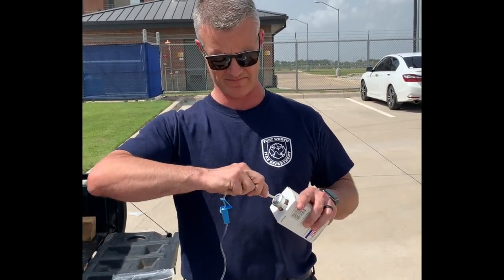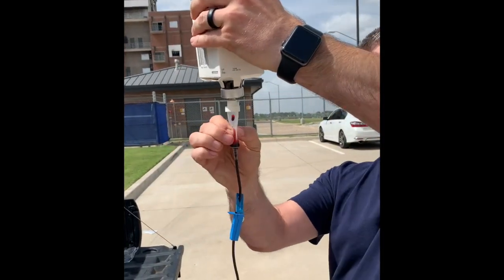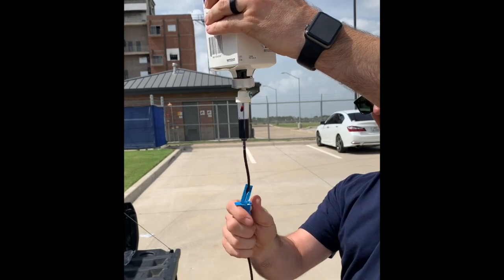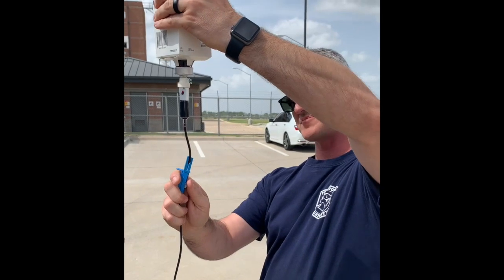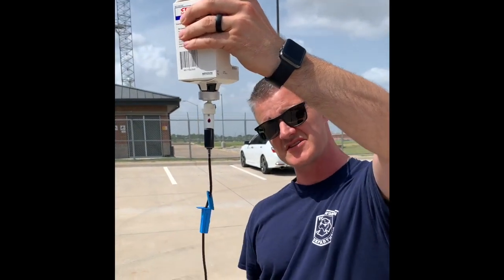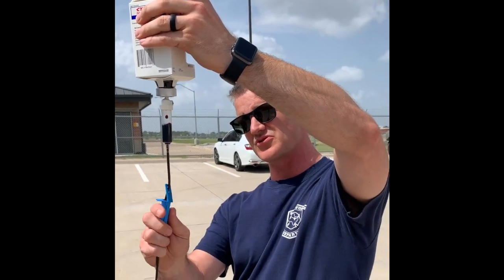After you've mixed and rocked your Cyanokit, you're going to stab it with this spike. Then you're going to fill that up to about the halfway point on this sight glass here. Open it up and you want about three drops a second. Your medics are going to tie this into a dedicated IV or IO access — you don't want to mix this with any other drugs.